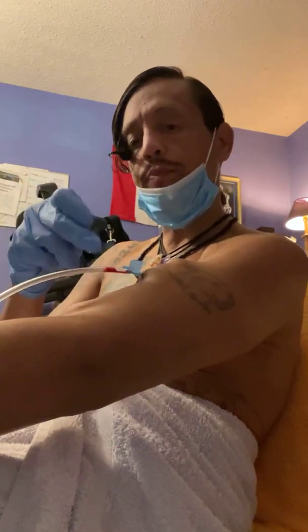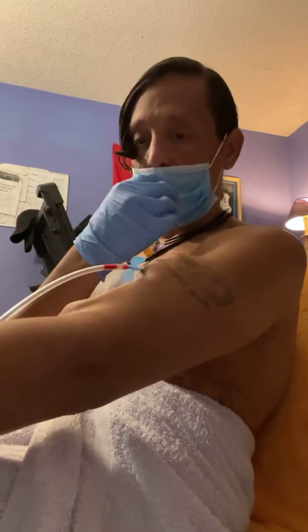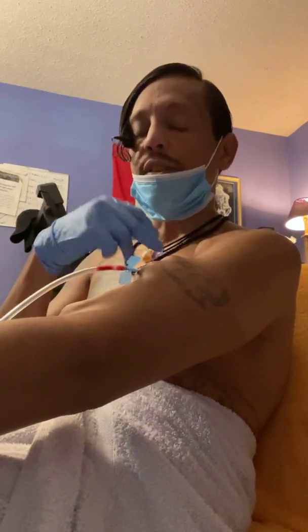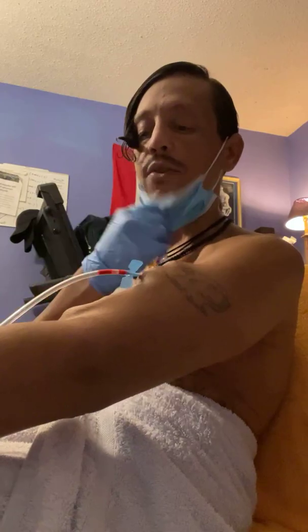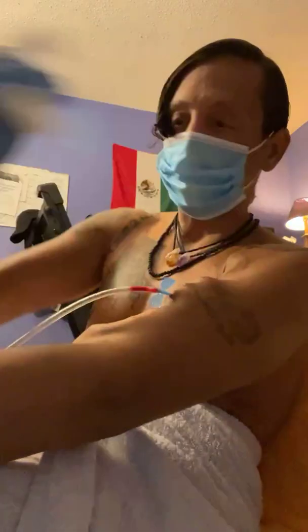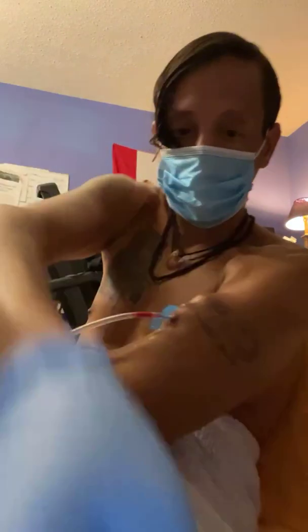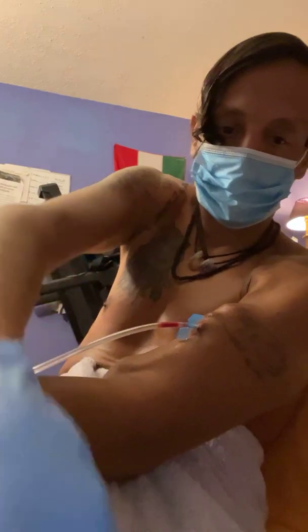Boom. And now you can see the blood flowing because it's inside the tunnel. It's inside the vein. This is not a graft. It's a fistula. It's my vein and my artery that got connected. So now all I got to do is tape this up. Make sure that it feels good. It's not painful. We don't want it to be painful.